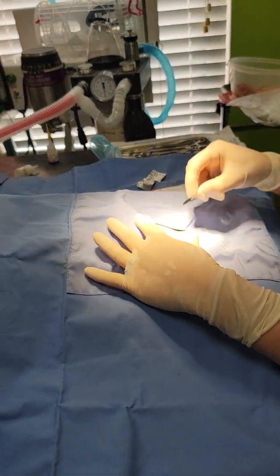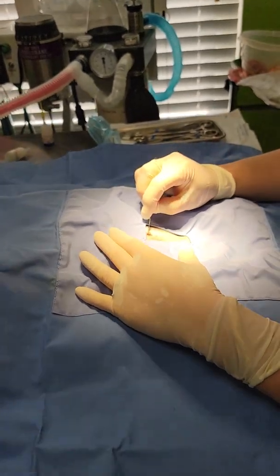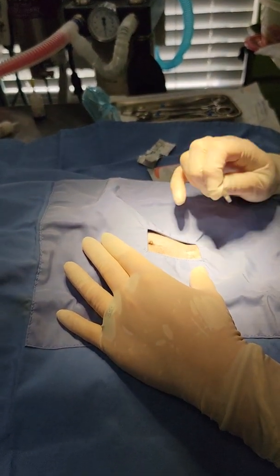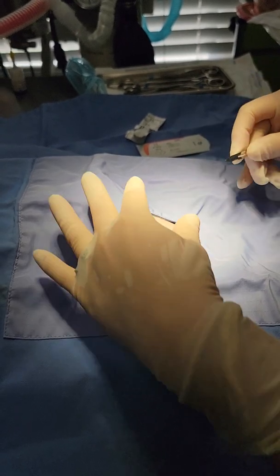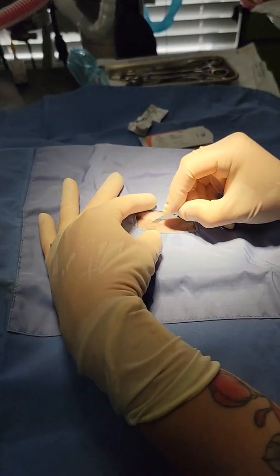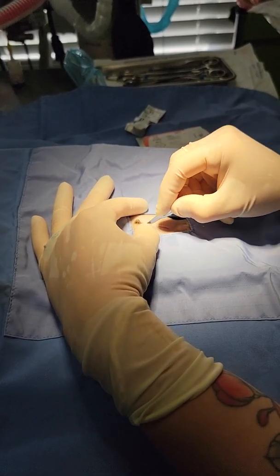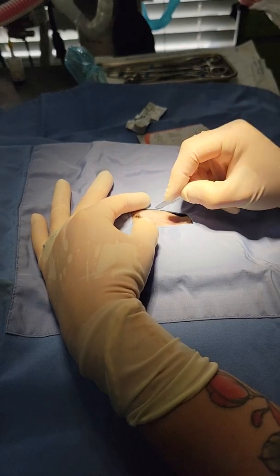For our incision, we're going to be doing a midline incision. The landmarks I normally use are the umbilicus, which is up here, as well as the hint of the prepuce here. I'm going to be using a number 15 blade — that's just what I like — for a midline incision. These guys are the most reactive when you're making the incision, it seems like.